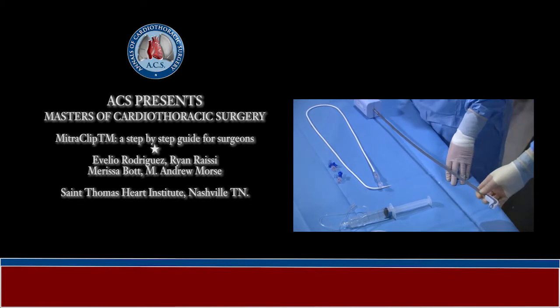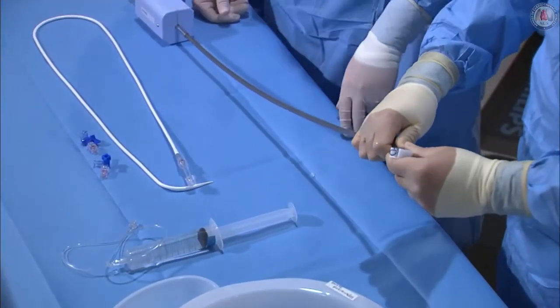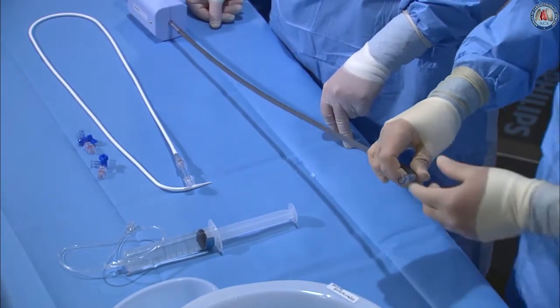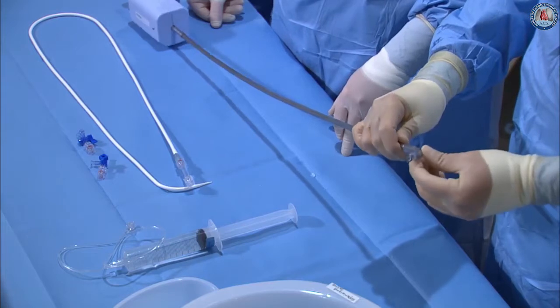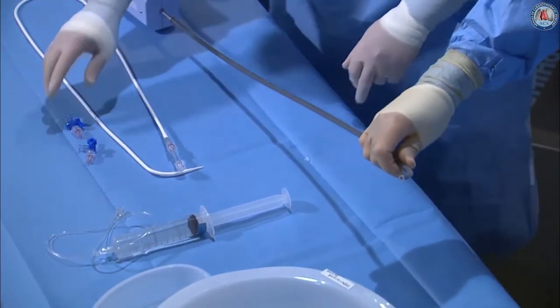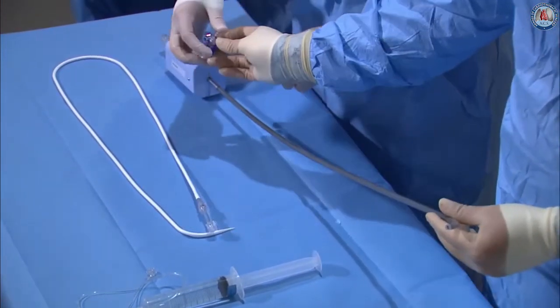We're going to start with the guide prep here. Here's our steerable guide. The first thing to do is remove the protective coverings off the tip of the guide, which has two layers — it peels off like a banana peel. Those are removed and put off to the side. Then we're going to take standard stopcocks and put them onto the back of the dilator and the guide itself.